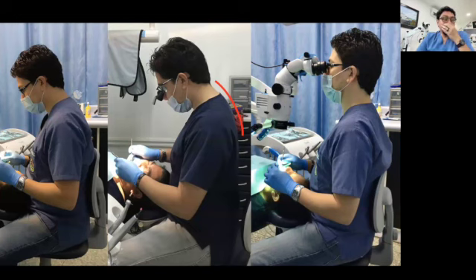If you are going to use loupes, it's important to have personalized loupes. And even better if the loupes are angulated, because if they are prismatic loupes and they have the lenses in an angulated tube, you won't have this problem with the neck.